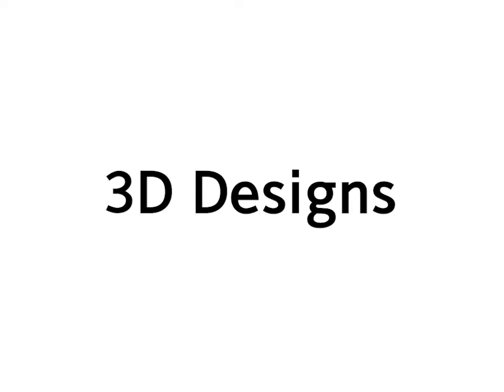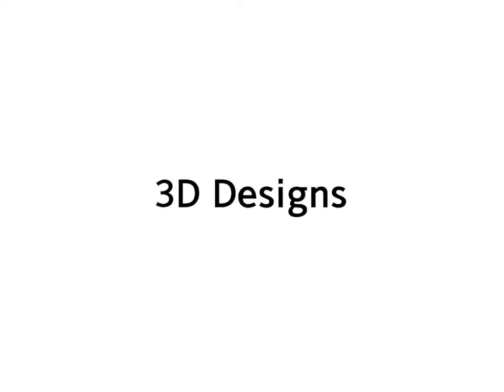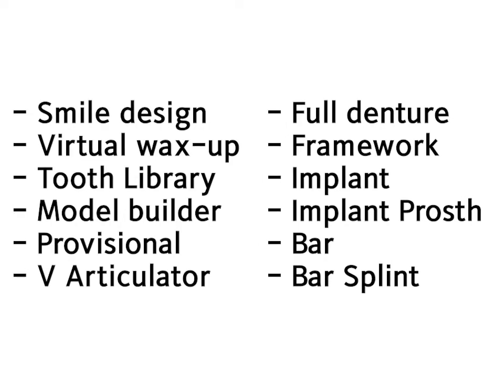Most design software are acquired in a standard version that allows to design common dental and implant restorations such as single copings or bridge frameworks or even, in some systems, post and cores. All systems have add-on modules that can be acquired independently, which extend the range of indications and design capabilities. From now on, we will discuss the main modules usually included in design software.